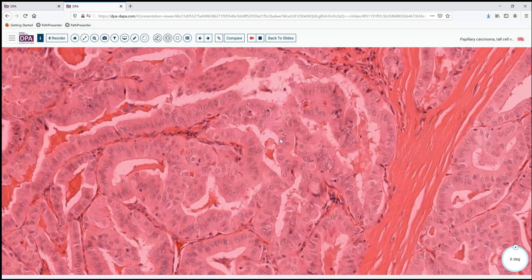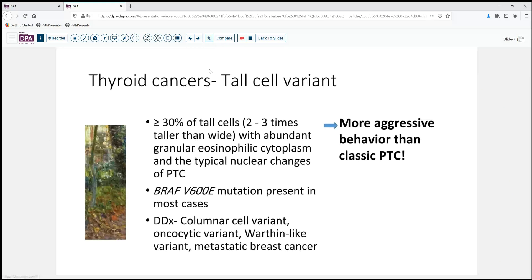This is a characteristic of tall cell carcinoma of the thyroid. So what is the tall cell variant? By definition, it's greater than 30% of the tumor composed of tall cells with two to three times as much height as there is width, and abundant granular eosinophilic cytoplasm in association with the nuclear changes of papillary thyroid carcinoma. These tumors most frequently have a BRAF V600E mutation. And so if you've done that molecular testing, or you do it subsequently to guide treatment, that will become evident.